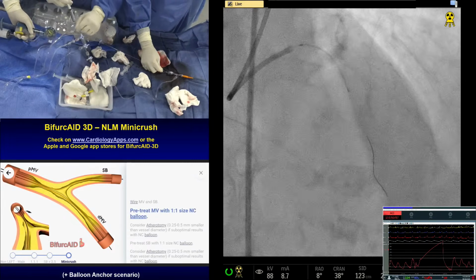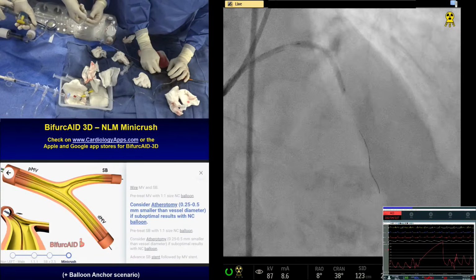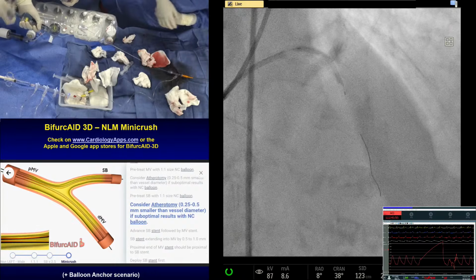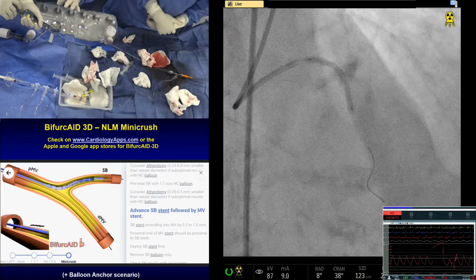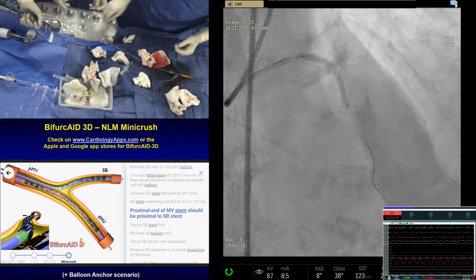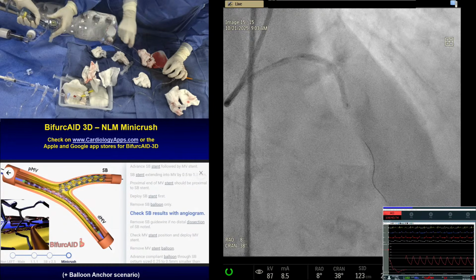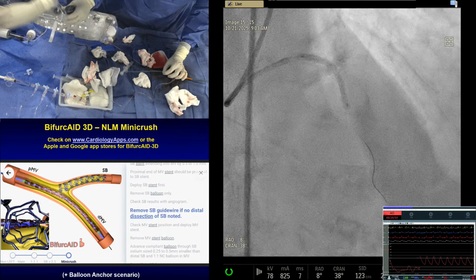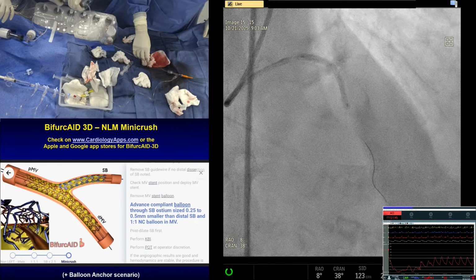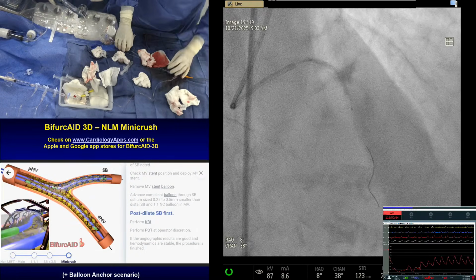Okay, go up. Go up. 14. No, go again. 14. Just leave it for a few seconds. Yeah, these guys, they go up and come down. No, the Huda is teaching them. You have to give it a few seconds. I mean, we are fast, but at some point you have to let the balloon inflate. Yeah, be fast at the right step, not with the inflation and deflation.